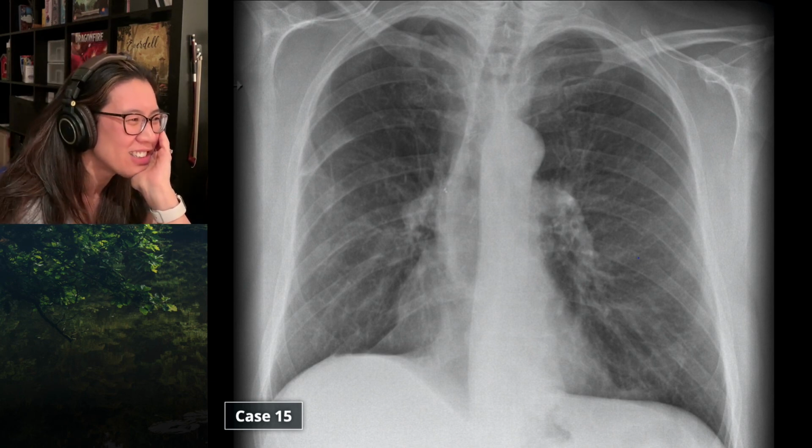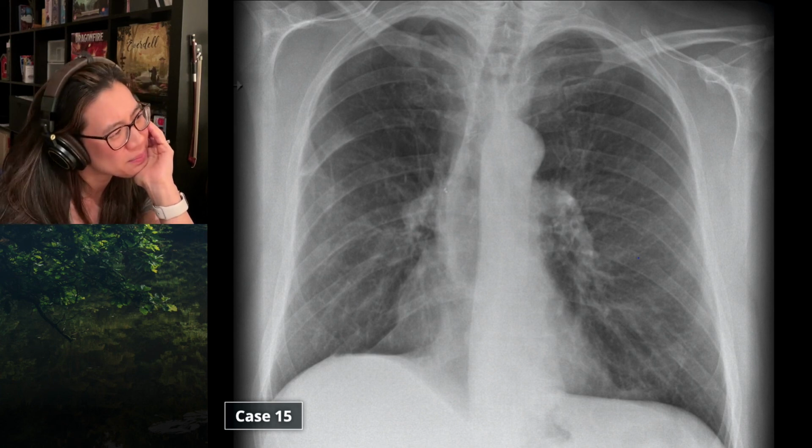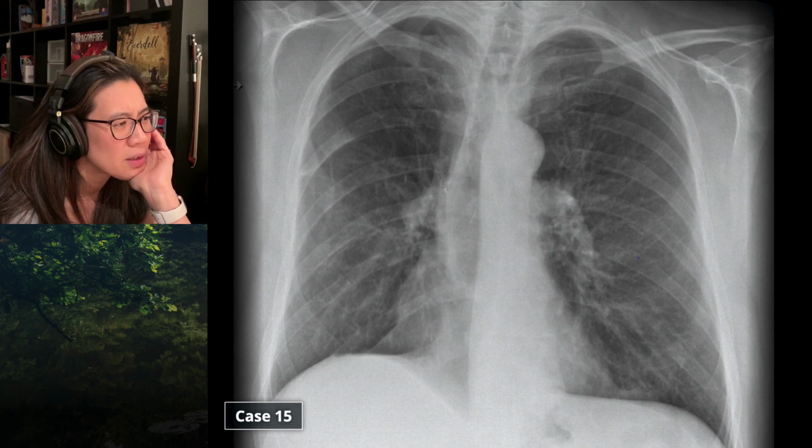That's right middle lobe up there. So sometimes when you do a right upper lobectomy, the lower apex of the lower lobe goes to the apex, and sometimes the middle lobe goes to the apex. Sometimes they actually do a pexy of the middle lobe to stop it going up there, which they haven't done in this patient.